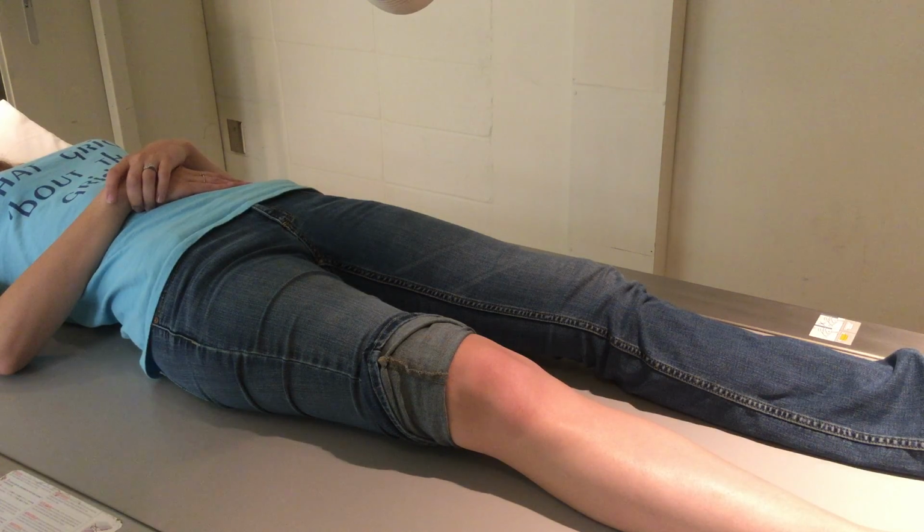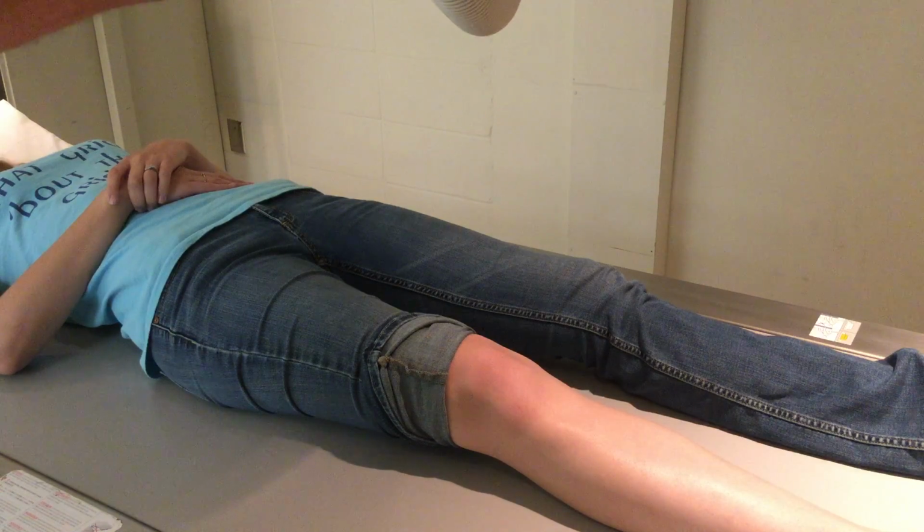You shoot this in the table bucky. Up until now, the lower extremity work we have done has been tabletop, but knees are typically over 10 centimeters all the way around, and so you move into the bucky. It cleans up the picture quite a bit. So you want to make sure you're detented left to right, and then you need your SID to be about 40.